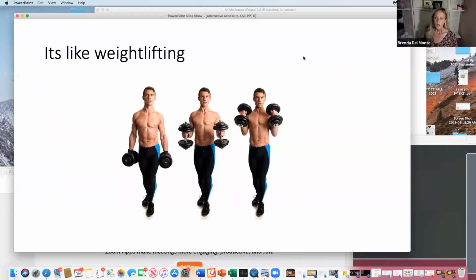So just to reiterate what I was saying about the 18 to 22 inches on eye gaze, when they're looking at it, it's like you're holding weights like this. And that's when I brought up the balloon situation. If they look out in the distance, then they get to relax their eyes a little bit. If something comes closer to them, then they get to pull in. And then they can come back to the device and make a choice without that muscle quiver.